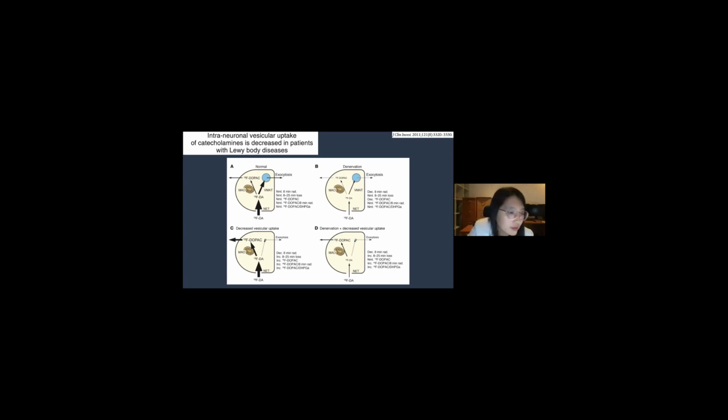Figure B, reduced sympathetic innervation decreases total neuronal uptake of F18-labeled dopamine, which results in decreased initial myocardial radioactivity. The rate of loss of radioactivity is normal. Figure C, reduced VMAT activity decreases radioactivity because augmented F18-labeled DOPAC production accelerates loss of cytosolic F18-labeled dopamine.